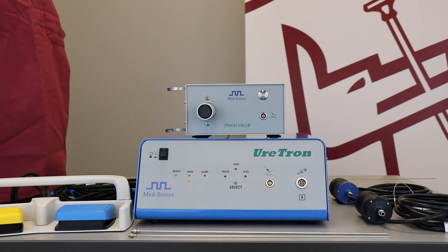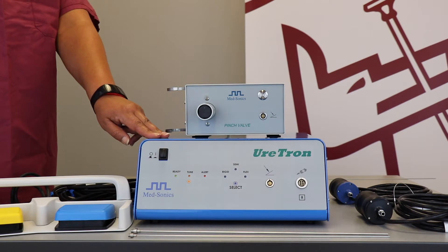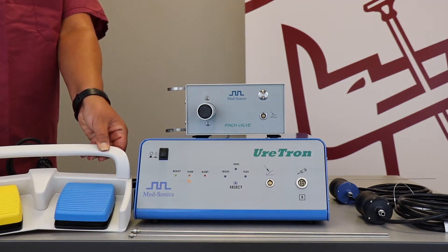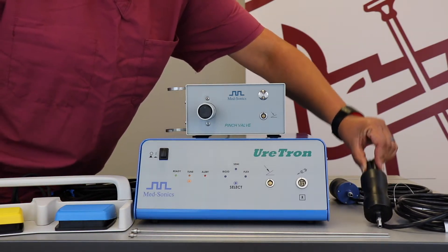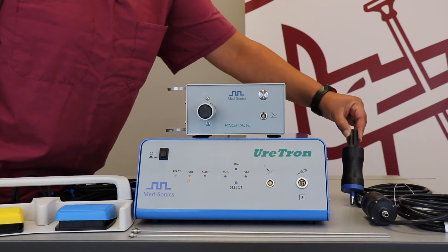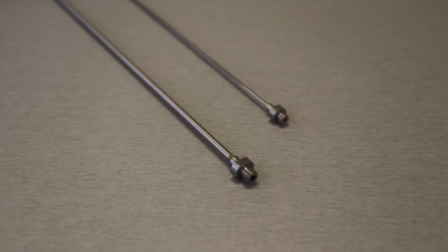Shown in front of you is a complete Uratron system, which includes the suction pinch valve and the generator shown below. Off to the left is a dual foot switch which has yellow and blue pedals. Off to the right we have our all-black handpiece, which is used for rigid probes only, as well as the blue handpiece which is used for semi-rigid probes. We currently offer rigid and semi-rigid probes in a variety of lengths and diameters.